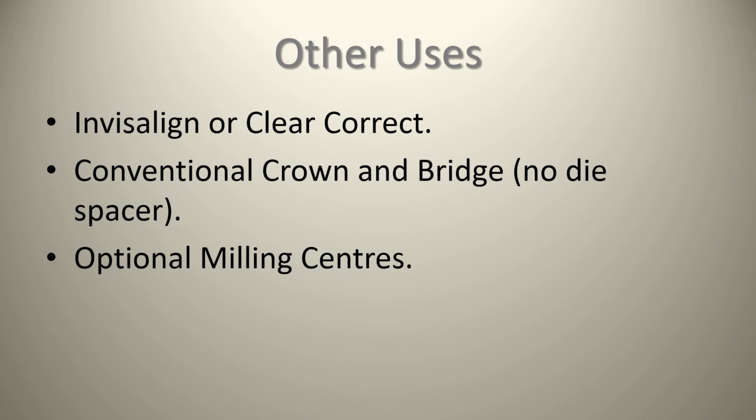And anyway, this is something you can consider. Some of the crowns that I've also seen that have come out of these machines are not necessarily the greatest. Some I've even said kind of look just like glorified temporaries that we make in the office ourselves, as compared to some of the lab work that I get from some of my master lab tech colleagues. So, hex or non-hex impression coping.